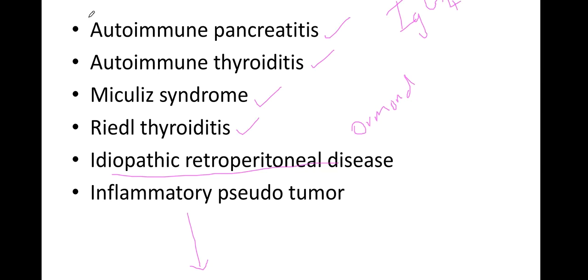So with all of these diseases, when I see the above mentioned picture, what I've reported for this histopath slide which you saw was autoimmune pancreatitis, probably IgG4 mediated. That will be my diagnosis. Then, yeah, when I have this diagnosis, you're going to have a clear-cut treatment protocol for that. That will be discussed by Dr. Rahul Rajiv in the video soon, right? So I can have a diagnosis and I can have a treatment.